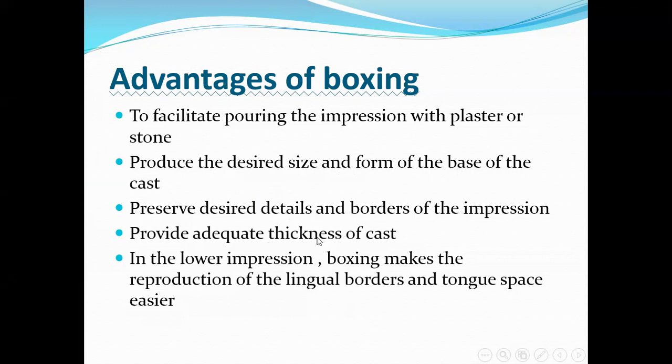The thickness that we want depends on the height of the box that we make. In the lower impression, boxing makes the reproduction of the lingual borders and tongue space easier.